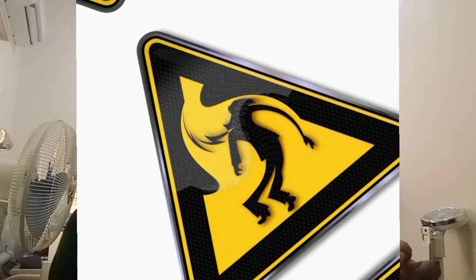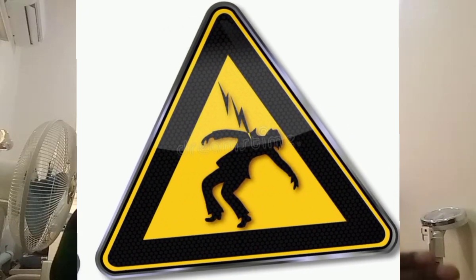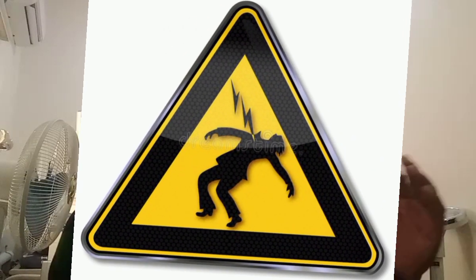So the operator should regularly inspect the transducer cable for cracks or breaks that might cause the operator or the patient to receive an electric shock. That is in the area of quality assurance and maintenance. We'll look at that in some other lectures.